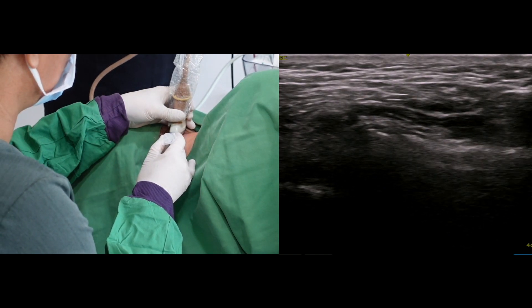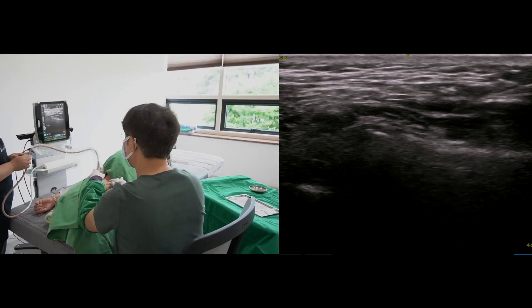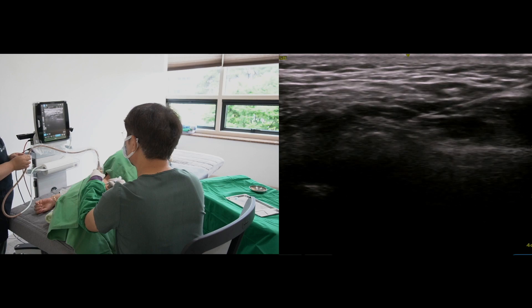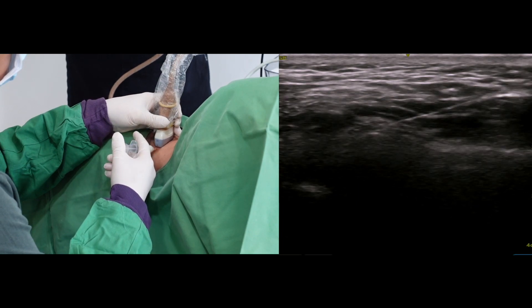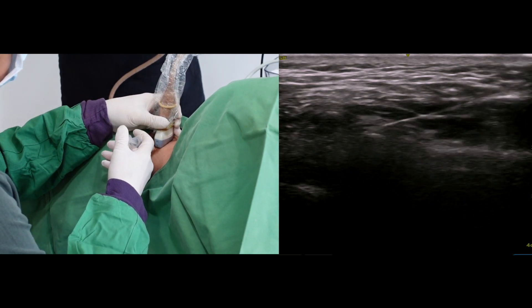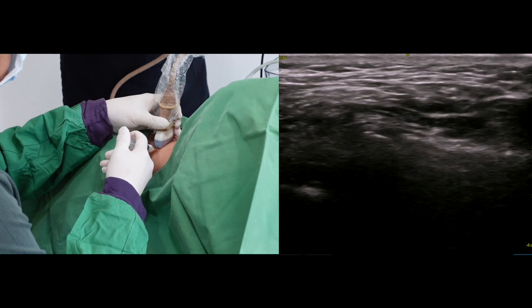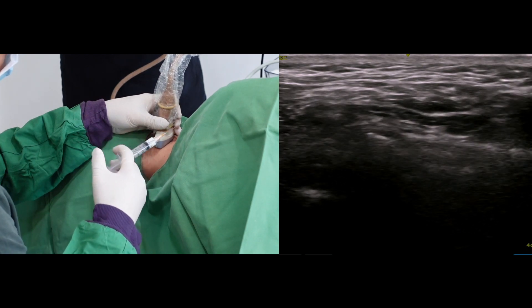You may notice how carefully I scan before placing the needle. Once your needle is in the right place, watch your feeling of piston resistance and fluid distension. Low resistance and scant fluid distension are the critical elements confirming correct needle placement.